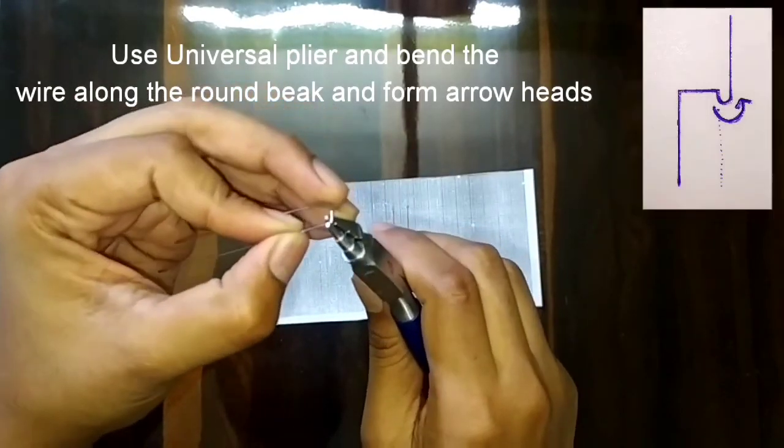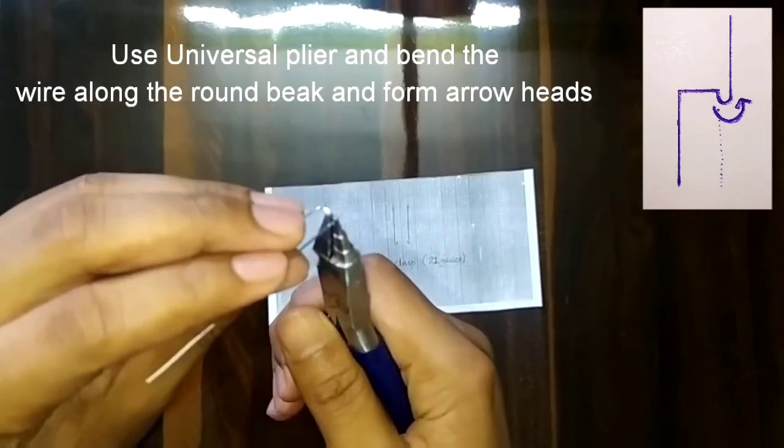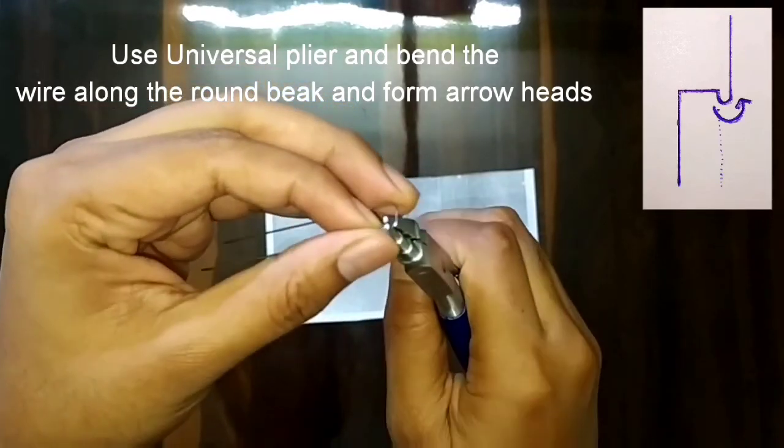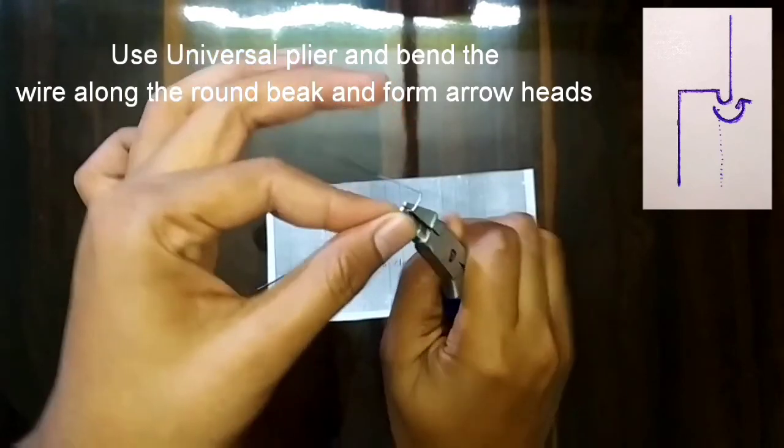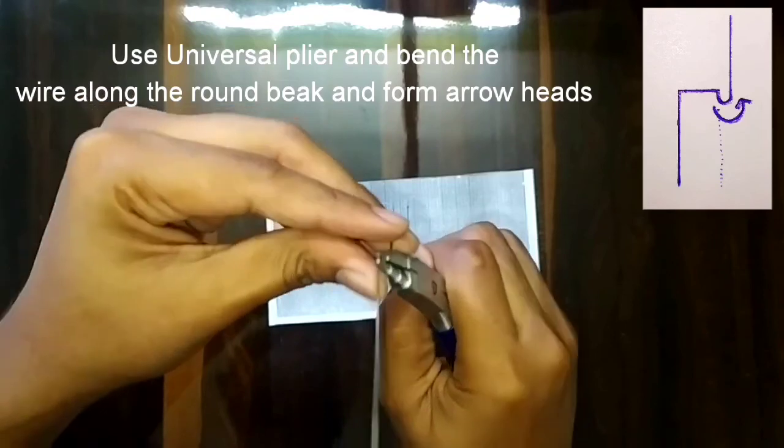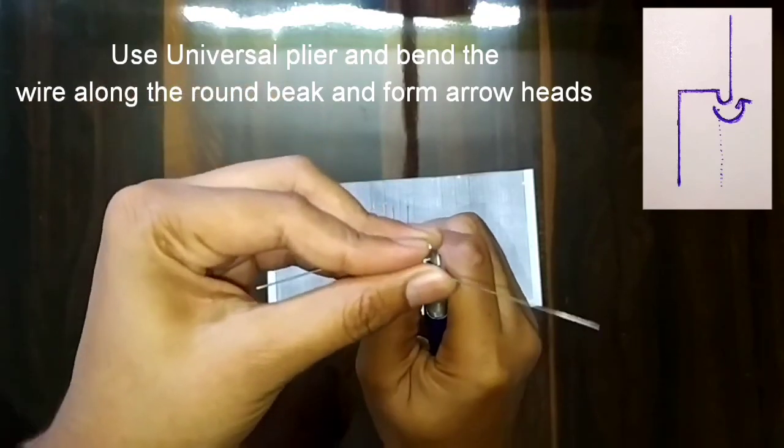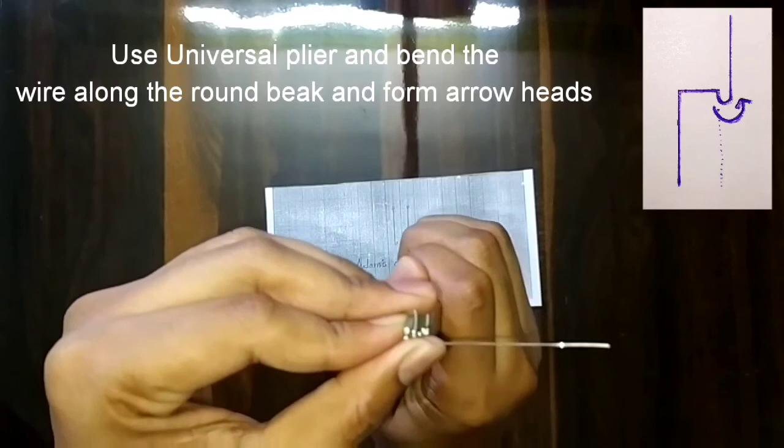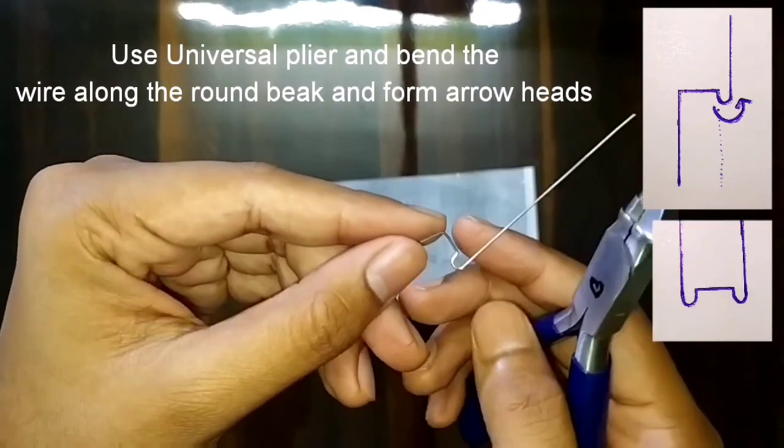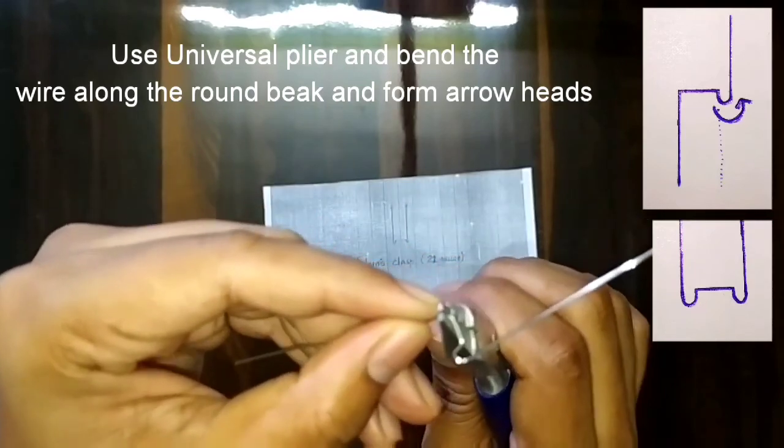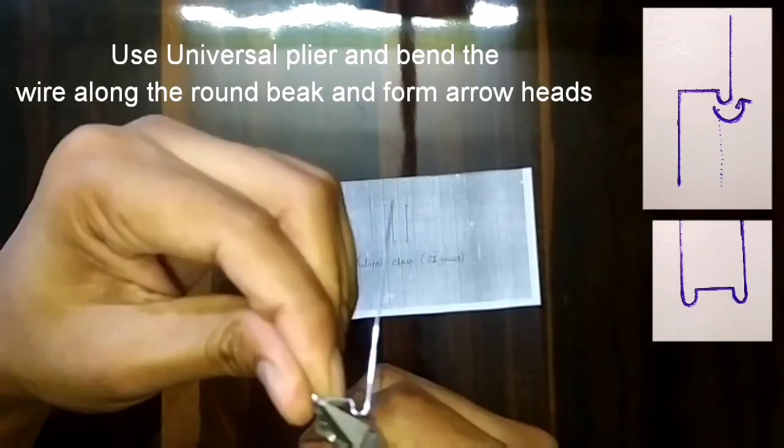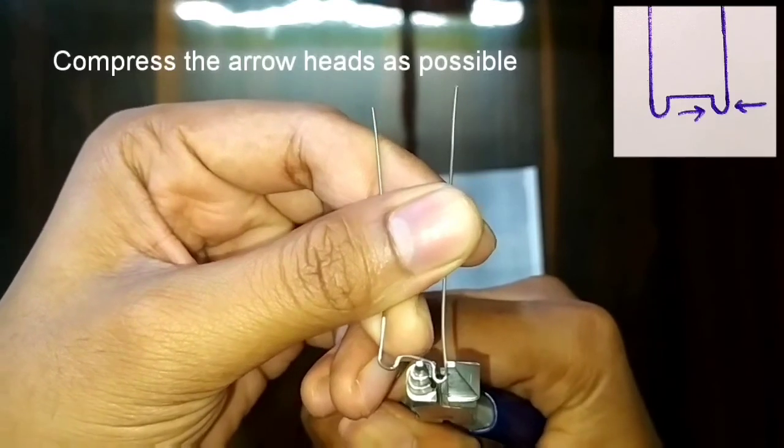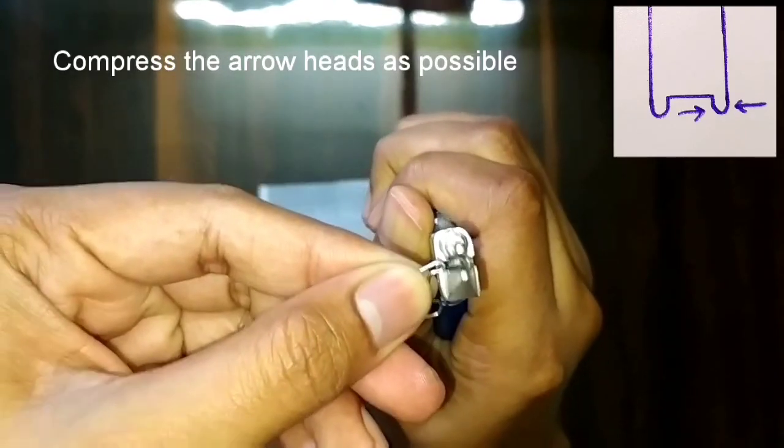To make the arrow heads, hold the wire with the tip of the plier in this position and roll the wire along the round beak as I am doing with the help of the finger and thumb. A round curvature will be formed there as shown in the diagram. Do similarly on the other side also. After this, we will compress the arrow heads and try to make it as narrow as possible.